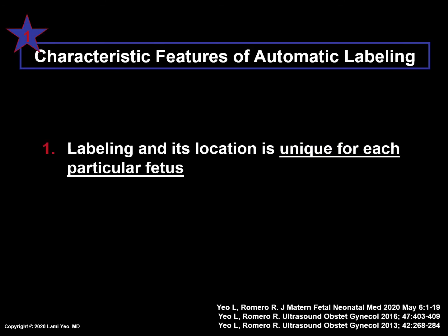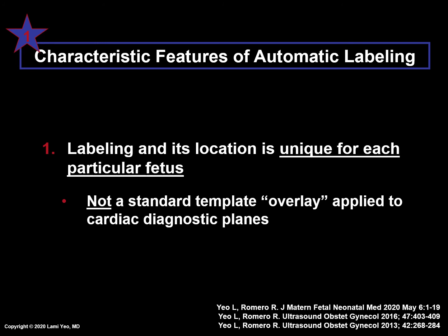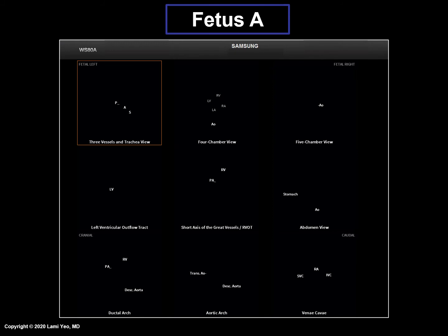The first characteristic feature is that labeling and its location is unique for each particular fetus. It is noteworthy that automatic labeling is not a standard template overlay applied to cardiac diagnostic planes. For example, this is fetus A, in which we have removed the diagnostic planes on purpose — please note the labeling of the anatomical structures. As we show fetus B, notice that the labeling of anatomical structures is completely different and is unique for this particular fetus.